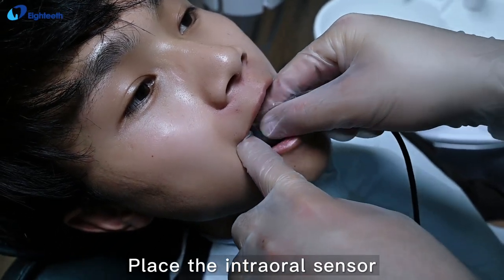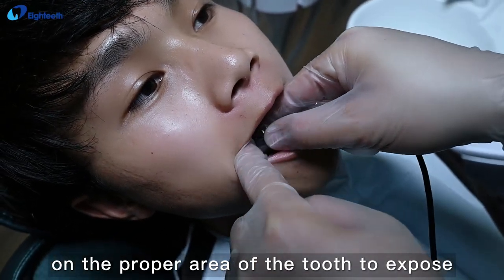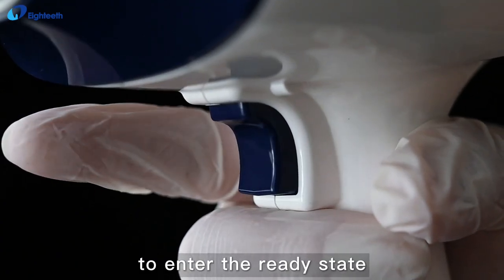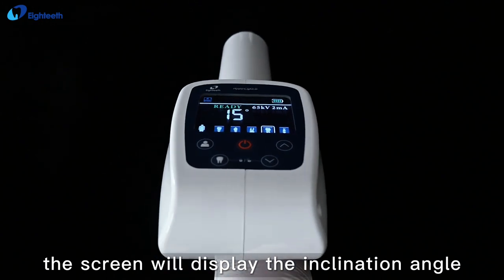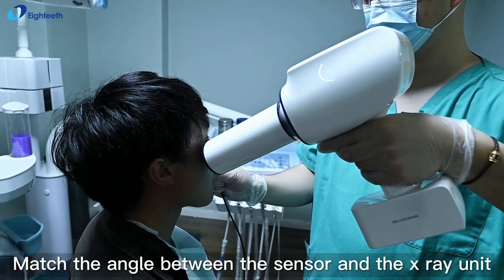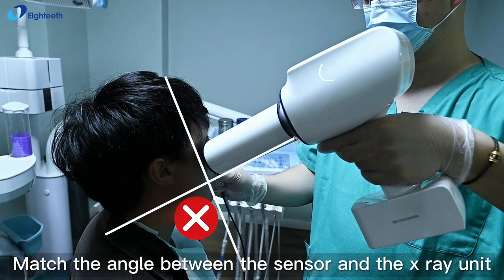Place the intraoral sensor on the proper area of the tooth to expose. Short press the exposure button to enter the ready state. In the ready state, the screen will display the inclination angle of the machine to the ground plane. Match the angle between the sensor and the X-ray unit.